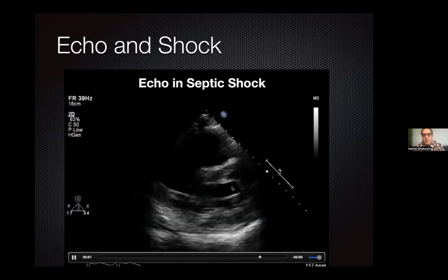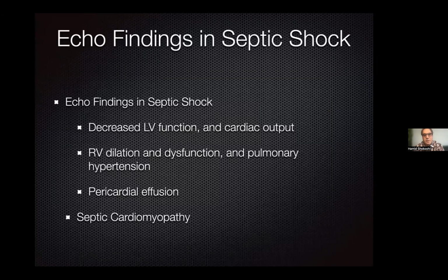Some pictures of the cases with sepsis. We talked about this one. Everything that you saw in the beginning is just the beginning of the sepsis. If the patient has sepsis or advanced shock for a little bit prolonged, we have something called septic cardiomyopathy. So this is actually the direct impact of the sepsis on the heart, basically.